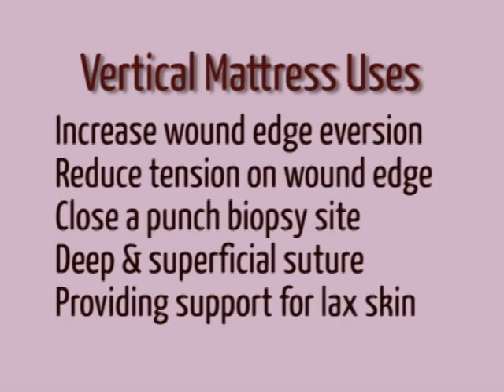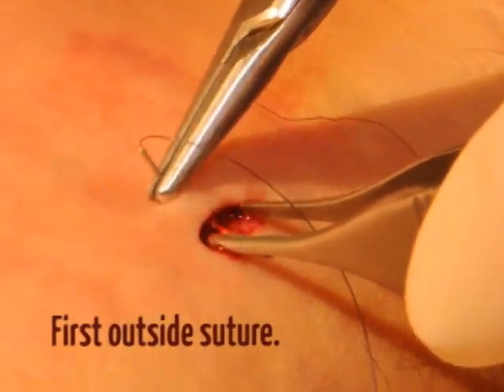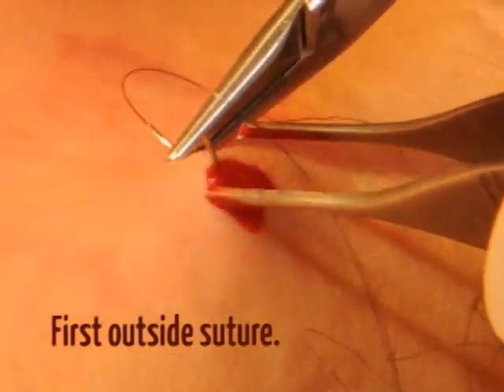Vertical mattress sutures are used to increase the eversion of and reduce the tension on wound edges. Common uses include closing a punch biopsy site and acting as a deep and superficial suture to provide support for lax skin. A vertical mattress suture consists of a larger outside suture followed by a smaller inside suture.